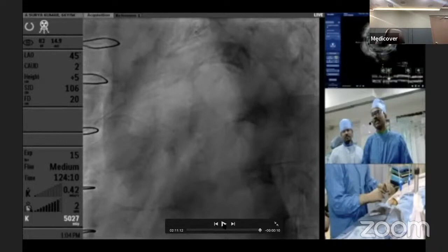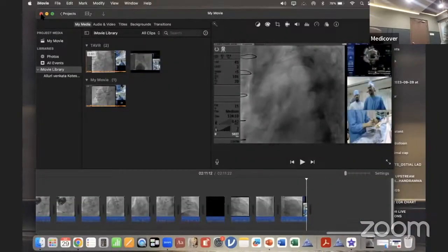Yeah, and again, it is to be done by a well-experienced operator. That is the first message you have to take, and how elegantly he demonstrated that every time he ensured that he is in the vessel architecture. That is the most important message you have to take. How careful he was. This case nicely showed how to differentiate between a graft and this, which was almost impossible till he reached the AV groove. That was an amazing demonstration. And for safety, each and every step, Sharath took all the care not to compromise the safety of the procedure. That is the most important message you have to take home when you do such a complex procedure. It's an amazing demonstration, Sharath.